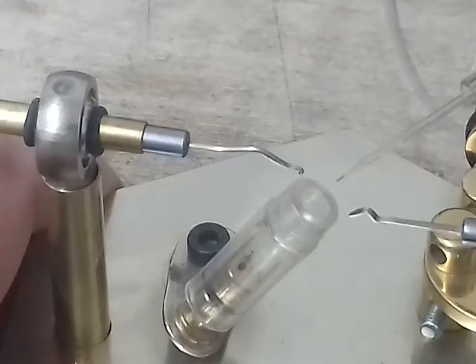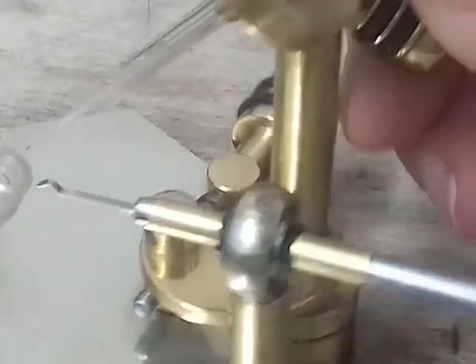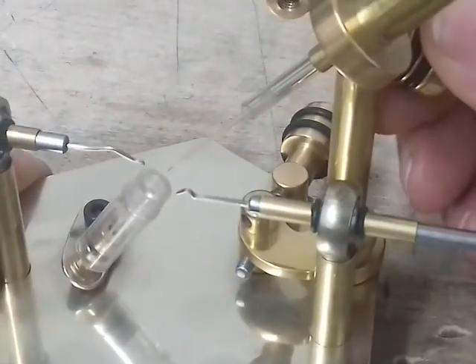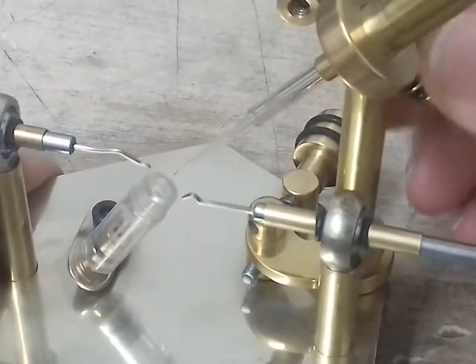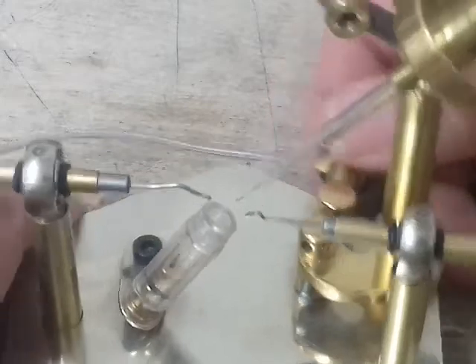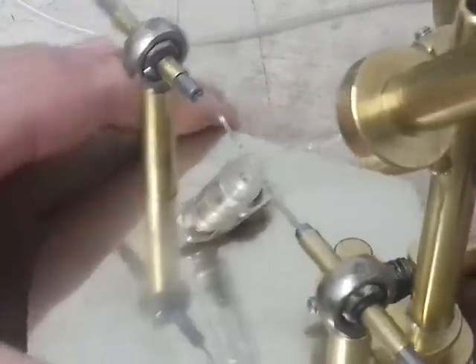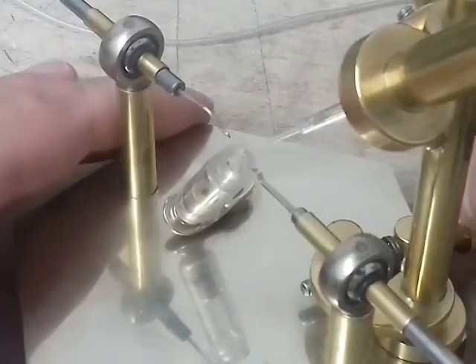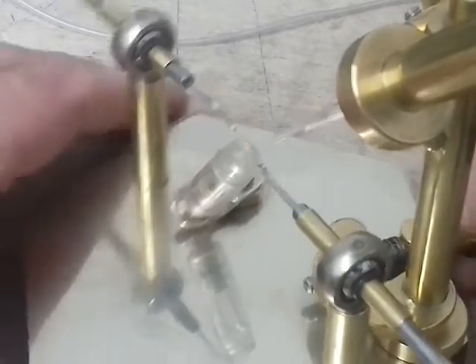So they can move up and down with this inch lever here. I'll zoom out slightly so you can see better. You turn that one for the vertical movement, and the other one for the lateral movement. You can't really see that well because the needle's clear, but the movements on it are so fine.